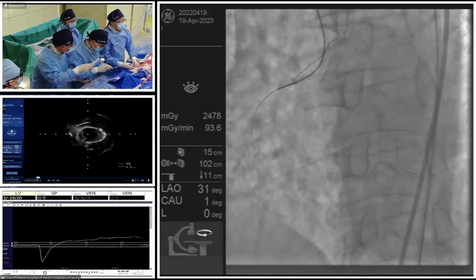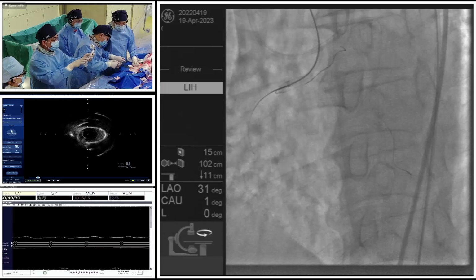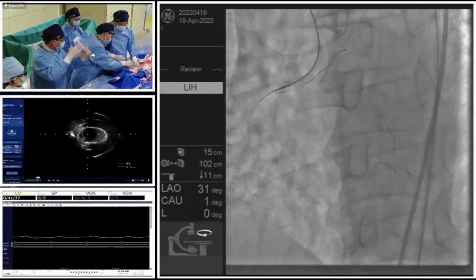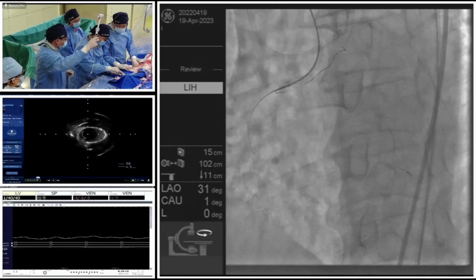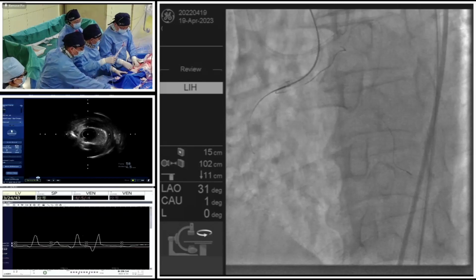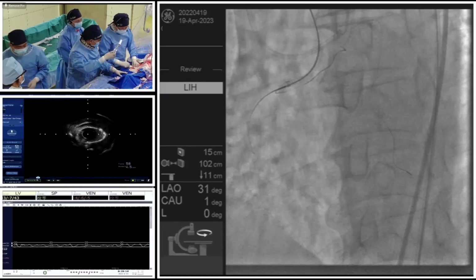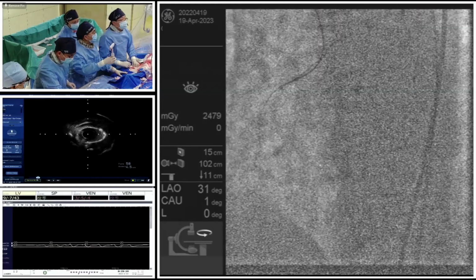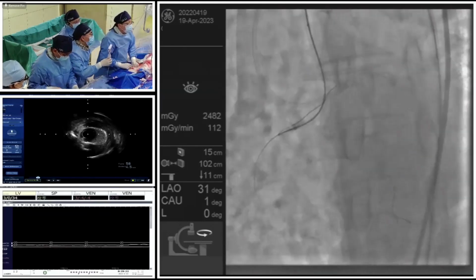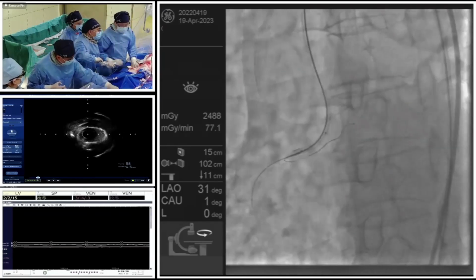This complex calcification at the proximal entry point zone causes the subintimal tracking and also makes the current procedure a little bit difficult, because we still worry about the healing of the entry point from the previous PCI. And also we can see, like we just mentioned, there are several collateral flows from the septal to the distal RCA. We are training the integrated parallel technique.